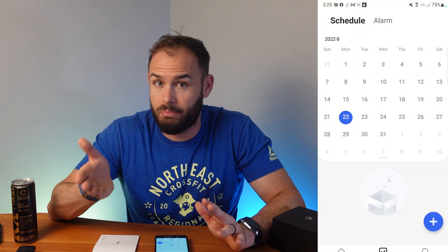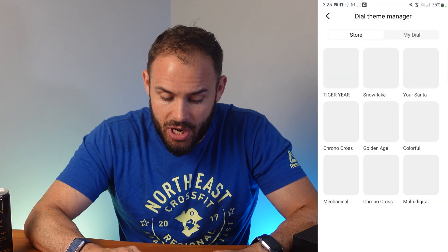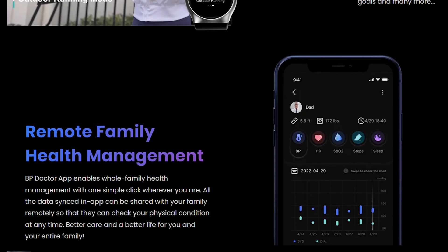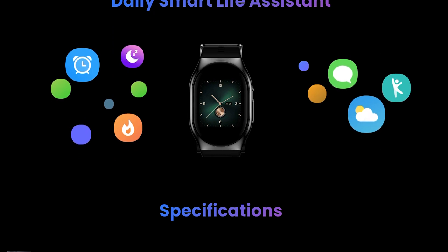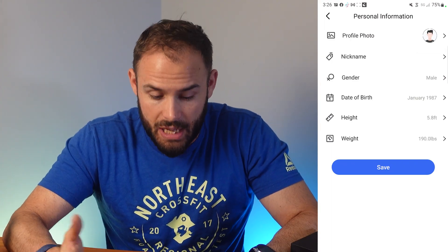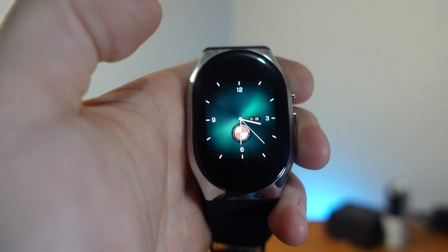Sleep tracking lets you know your wake time, deep sleep, and light sleep — but no REM sleep. Other app features include setting up a calendar to schedule different readings. In your profile you can change the watch theme through the store, change your dial type, update your goals, and add family members. It also shows blood pressure categories so you know where you should be. You can switch between imperial and metric units.